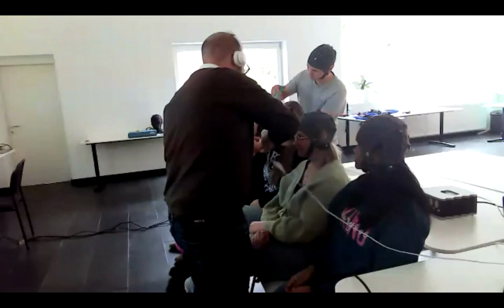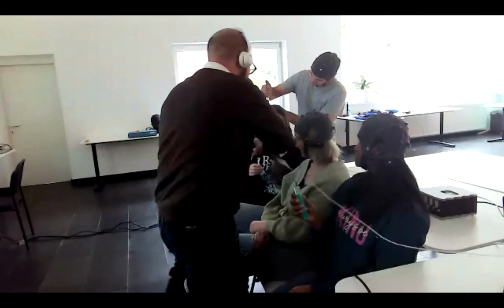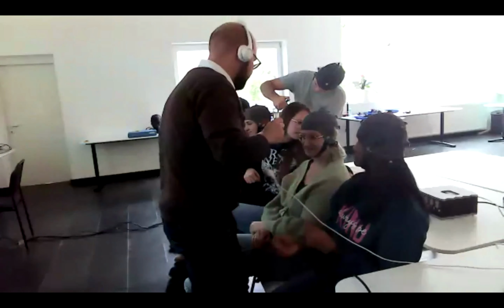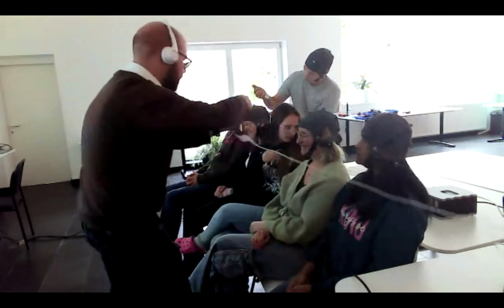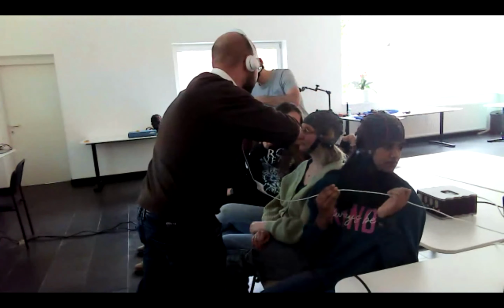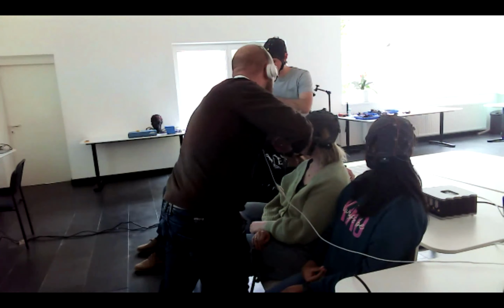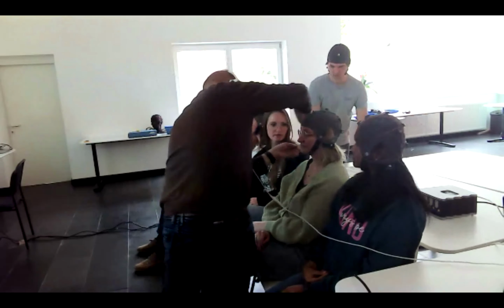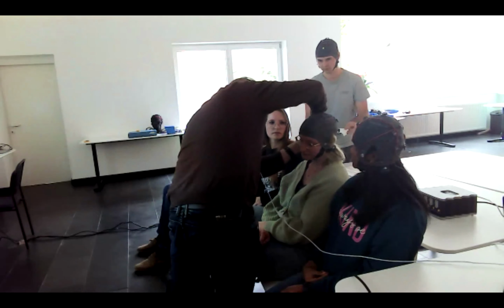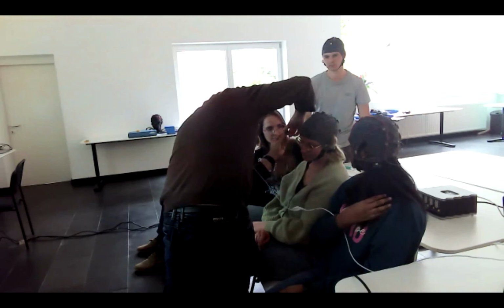So let me, exactly. This one is for you, this is for you. Actually, no. Can you give me a sticker on the back? This is, yeah, exactly, and it's just on the cap. Can you sticker? Yeah, exactly. So I'm using the ground behind the mastoid. So I'll just lift up, remove the sticker.